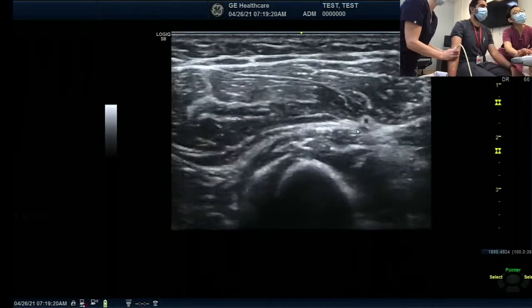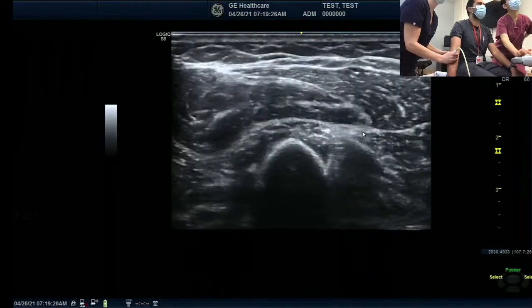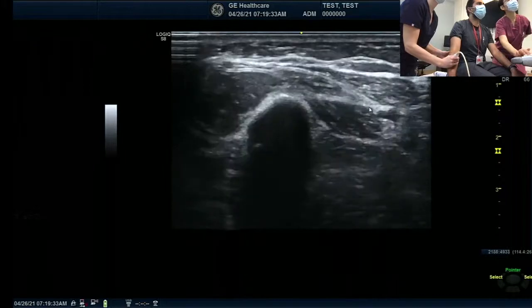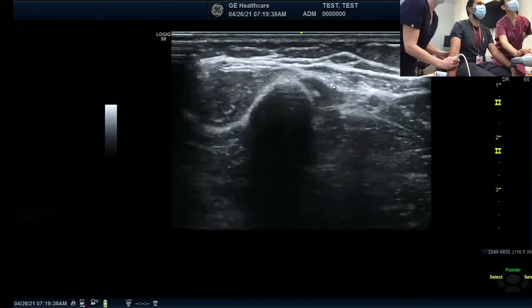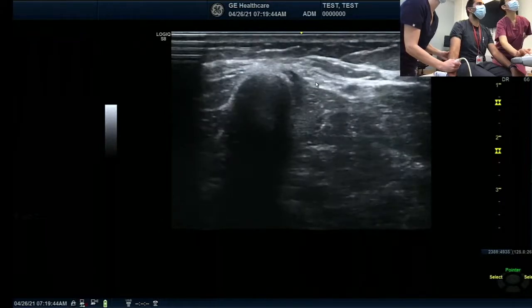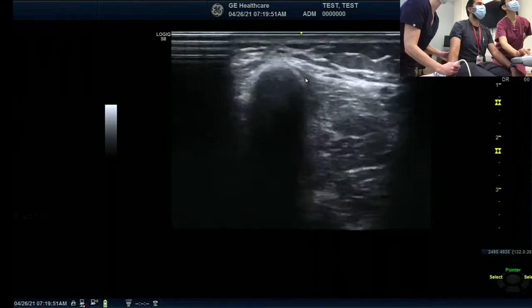Here still we see it. We see it here. Okay, continue. Follow that one. Here still. Yep. Still follow. It's going close to the superficial area. Oh, beautiful. Okay, toggle one more time. Here we go. Toggle. You can do wagging too. Okay, follow here. Actually, this time we follow better here. This one.